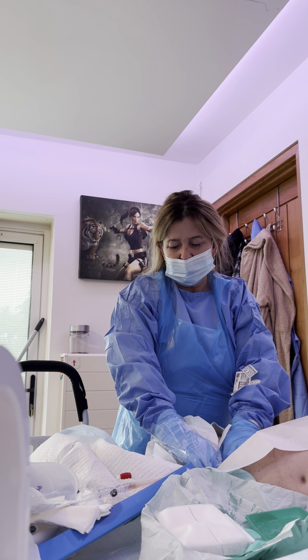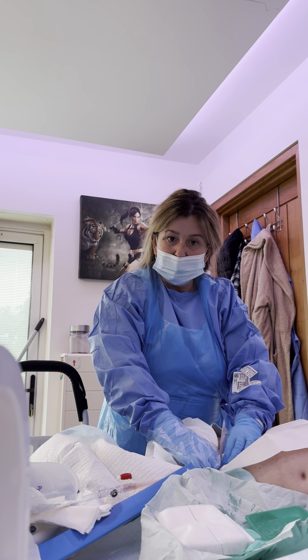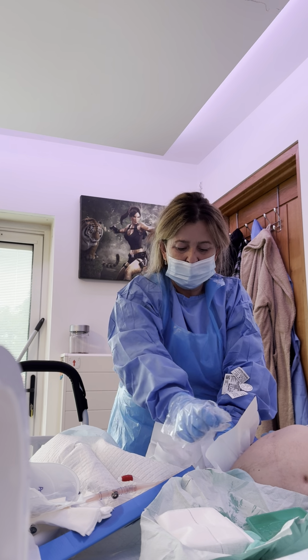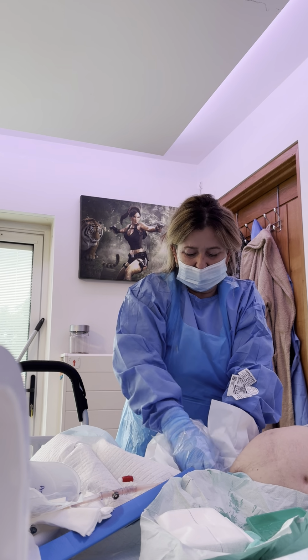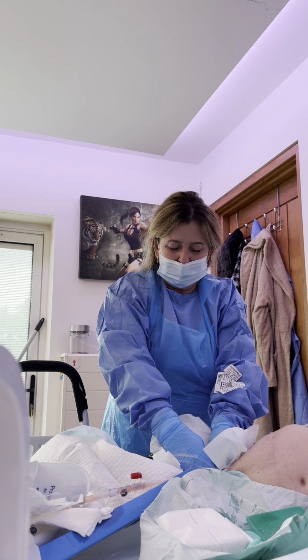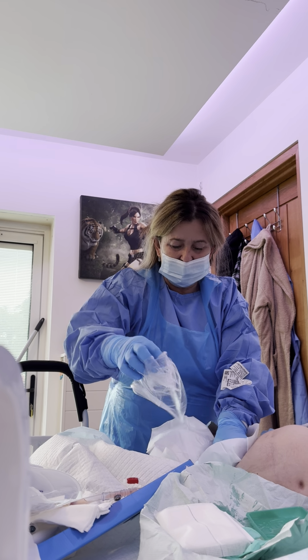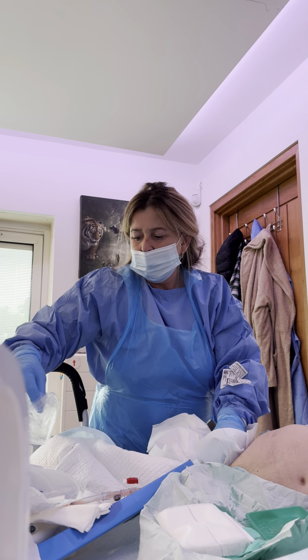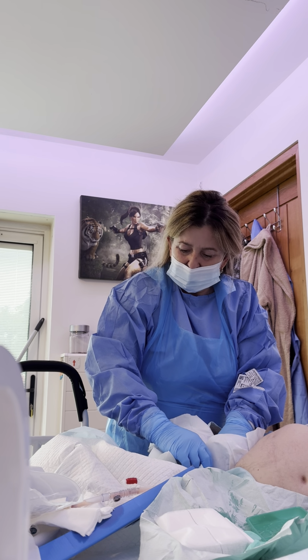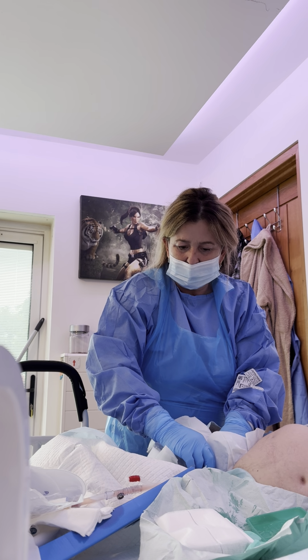And I'm holding it there for a second because now I'm going to pinch it with the inside of this. So I can hold on to that. Keep it in situ. How are you feeling? Bit AD, but... Bit AD? Not much. I'll de-glove that glove off, which is easy to do because I'll just take it off that way. It looks a bit complicated what I'm doing right now, but it isn't. Once that catheter's in, it'll stay there. De-glove. We've got babies going on in the background today. So I'm just making sure that that is in place.